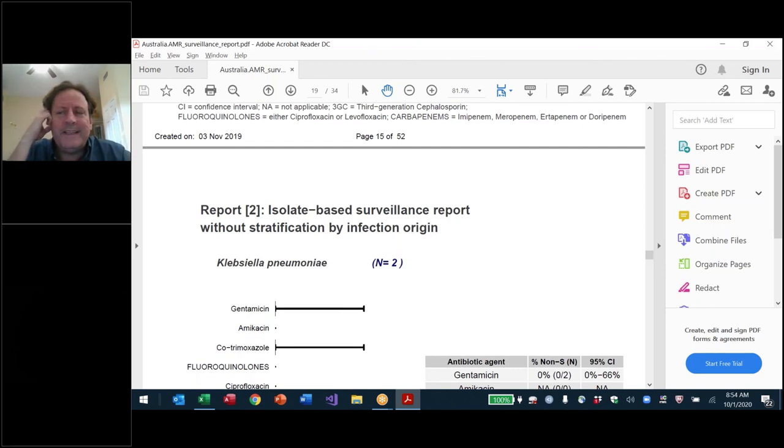So I have not given you an answer. There's always the ideal, and there's always what is realistic. And if your focus is to put out a published report with semi-reliable data, keep in mind that even excellent quality laboratories still have major problems of biases. It's not the laboratory's fault that people are not sending samples. People do not send samples for many reasons.